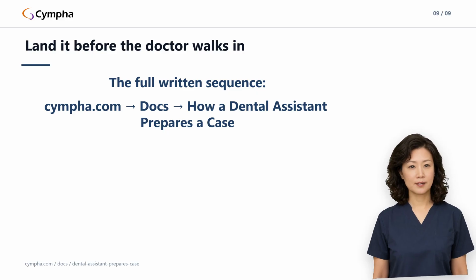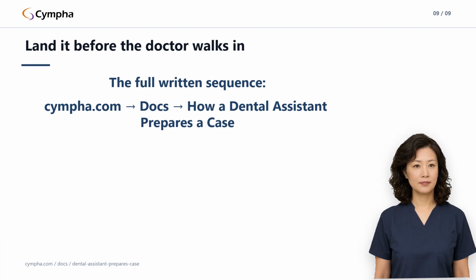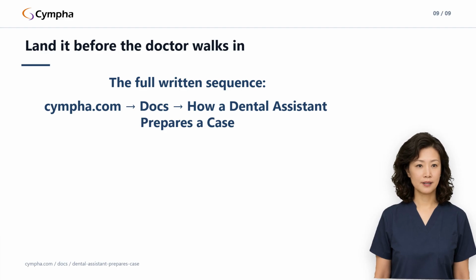Nothing in this sequence is hard. What makes it valuable is that it happens completely before the doctor arrives on every single case. Once it's muscle memory, the doctor never walks into a chair that isn't ready, and the case you prepped this morning is the same case the consultation, the patient share, and the lab order will all build on later. That's a lot of leverage for a few minutes of prep.